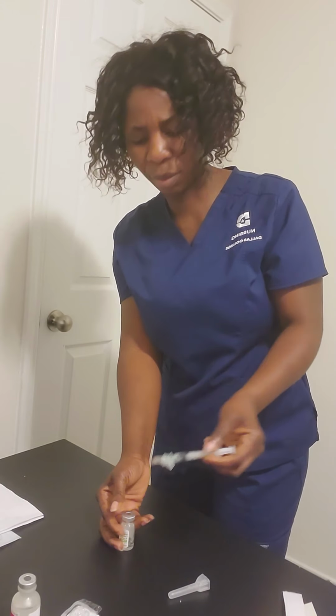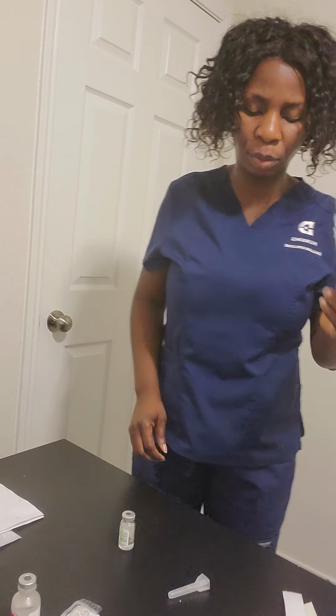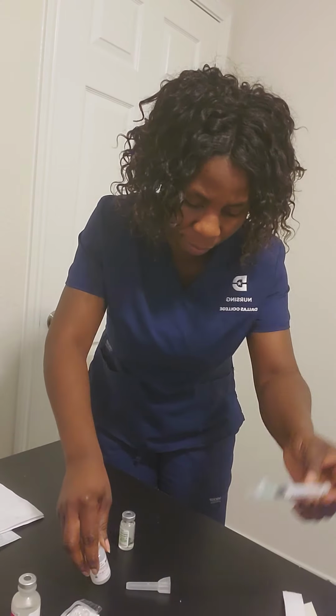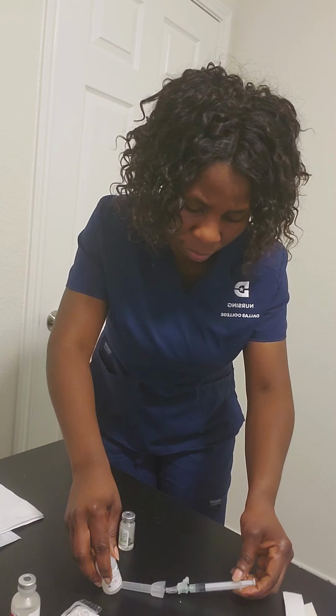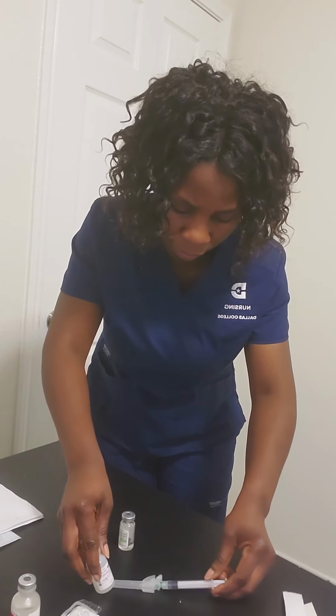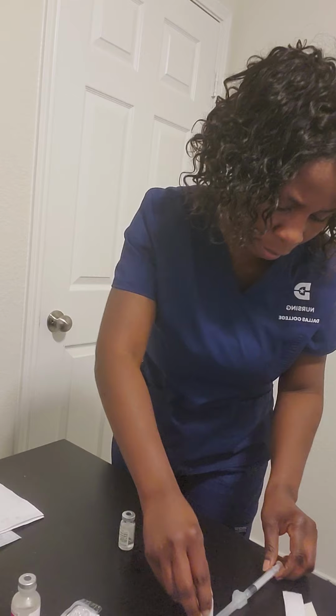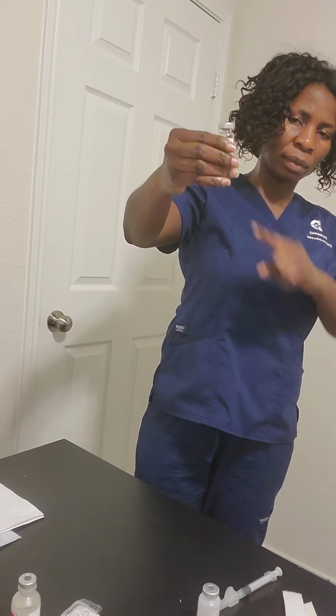So I'm going to take out my needle, and I'm going to provide safety by scooping. Don't forget, yes, provide safety by scooping. I'm going to scoop, put this here. Then I'm going to make sure I mix the water with the powder. I will roll it in my palm, and I will not shake. The instruction says do not shake, but I can mix it so that the one by the side will mix. Everything is evenly mixed now. I've been able to mix it.